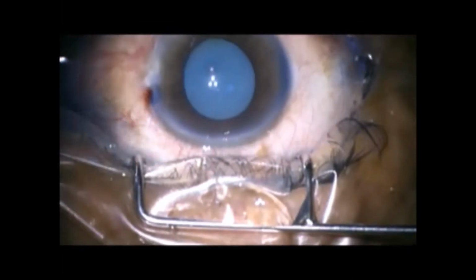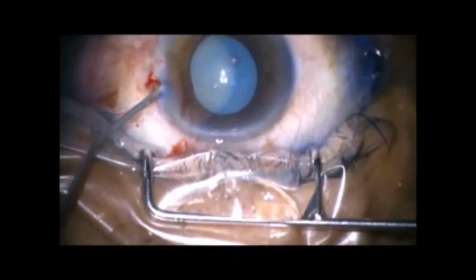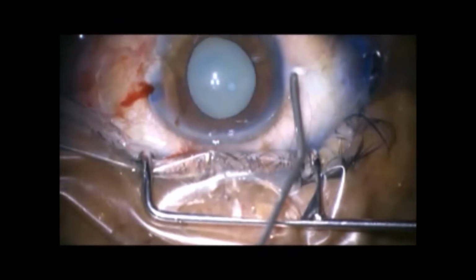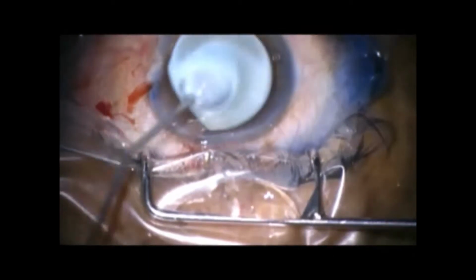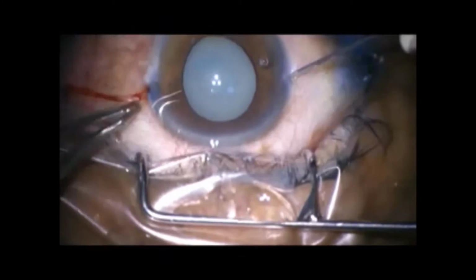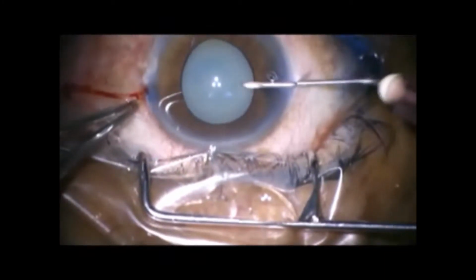The anterior chamber is now filled with viscoelastics. The use of ophthalmic viscosurgical devices is recommended to maintain the positive pressure in the anterior chamber. A 26 gauge bent needle is introduced through the side port to puncture the anterior capsule.